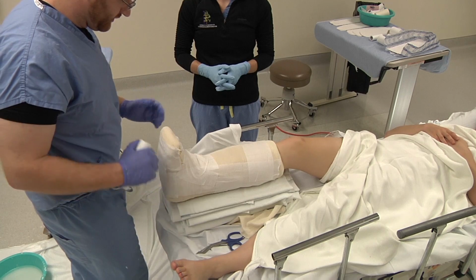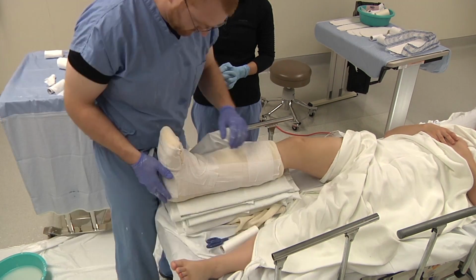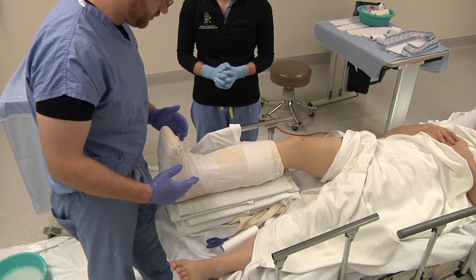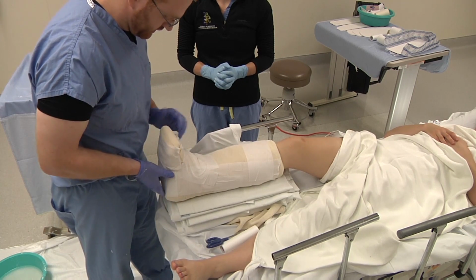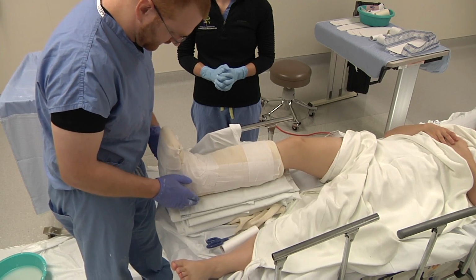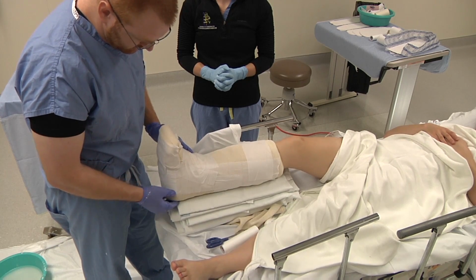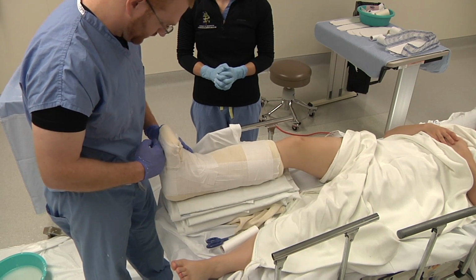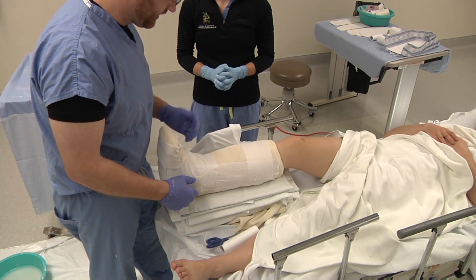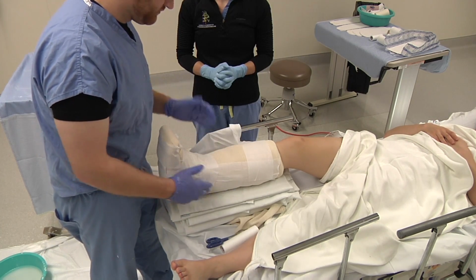Always after splinting, perform a post-splinting neurological exam. So common breakage points on a patient who may be intoxicated or fighting your reduction are, of course, they're going to want to contract or flex the ankle. So you'll get breakage here at the posterior slab where it alternates from the heel to the foot and the midfoot. People will flex through that. Even when a splint is semi-dry, it can still be broken relatively easily by a patient who's flexing.